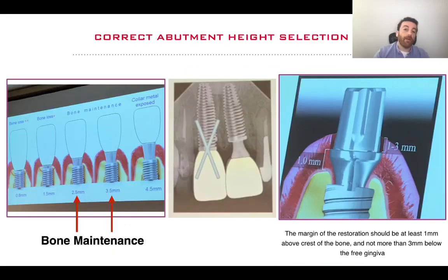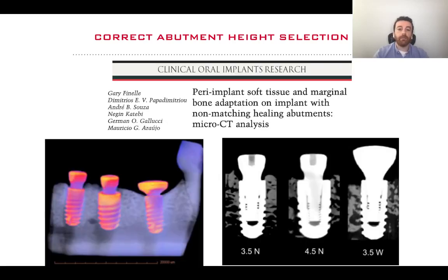And what does it mean in terms of abutment selection in these cases? Well, you don't want to have your abutment very close to the bone level and causing impingement on the blood flow around the implant and tissue in that area. So you really want to select abutments in the 2.5 to 3.5 millimeter height if possible, and that way you also have enough tissue protecting around your abutment to implant interface.